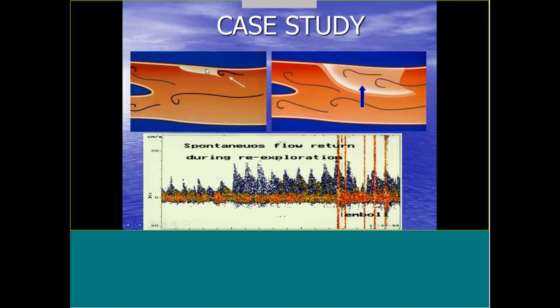This is a flap dissection. So what's happening here is the surgeon tried to pull all that plaque out in one piece, but left a little shelf in there that he did not see. Now, sometimes you'll hear surgeons say, could I have a tack suture? And a tack suture is where they use a little tiny suture to attach this plaque shelf to the vessel. Okay, so they just tack this up, just like putting a hammer and nail up on the ceiling.